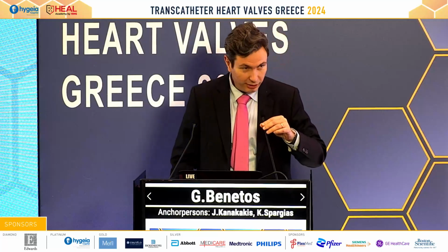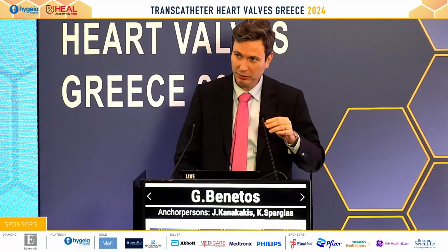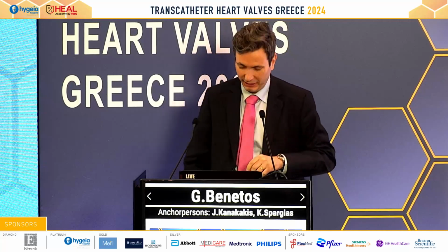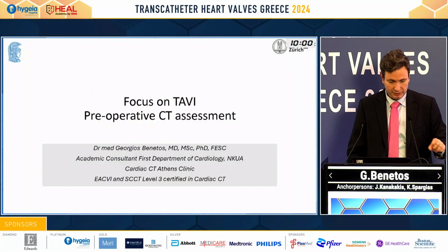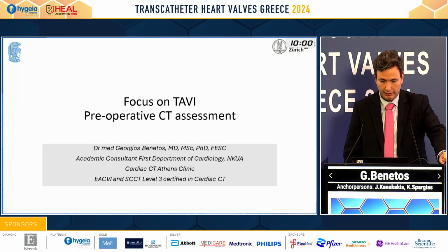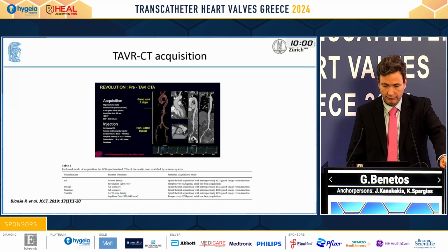I would say, to be honest, I don't feel very comfortable being an imager among so many interventional cardiologists and cardiac surgeons. I will try to give some data regarding the pre-operative CT assessment before TAVI.